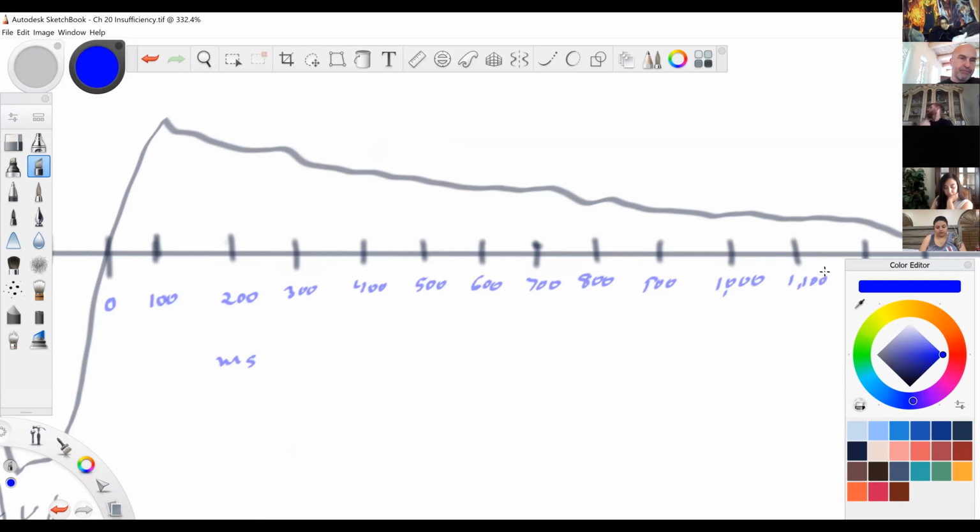Now I will tell you what is bad. I think in lab is a better place to physically talk about the exam, so I'll tell you a little bit, and then we'll talk about it in lab too. No matter what you're looking at, this is bad, because I've gone out past 1,000 milliseconds, which is also 1 second.